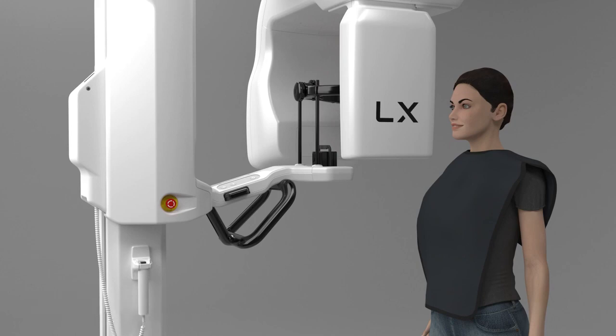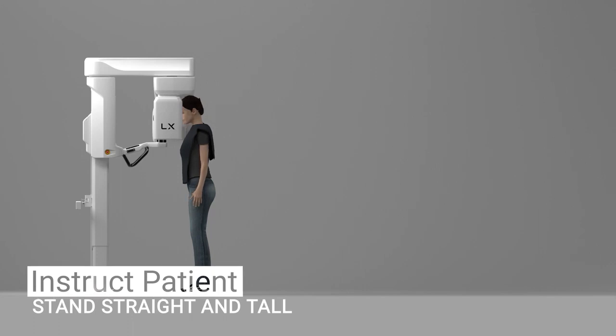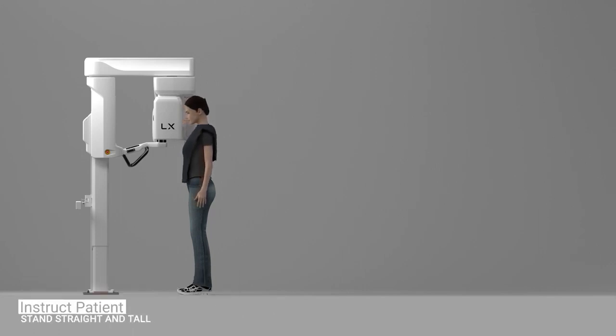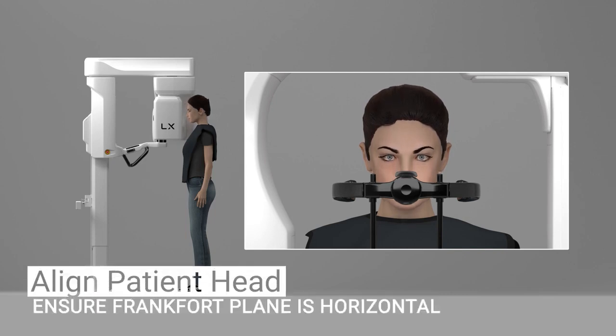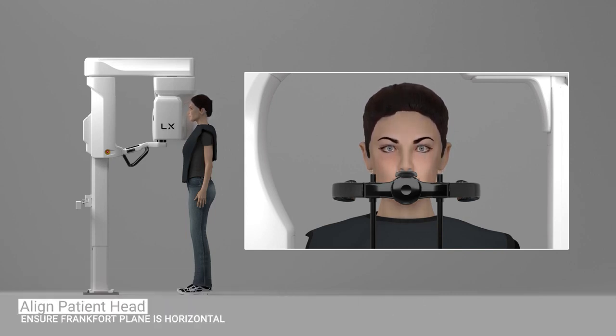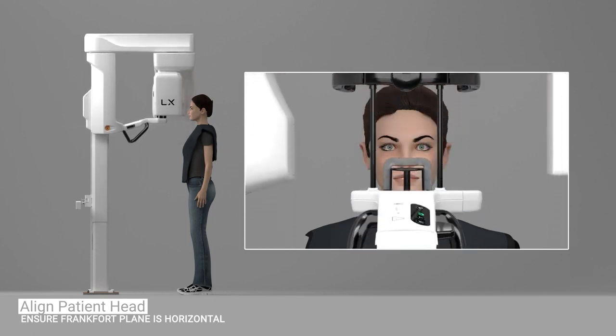Have the patient stand in front of the unit. Instruct them to stand as straight and tall as possible, with their feet at shoulder width. Adjust the patient's Frankfurt plane, which should be positioned parallel to the floor. Raise or lower the unit as needed so the patient's chin is level with the chin rest.